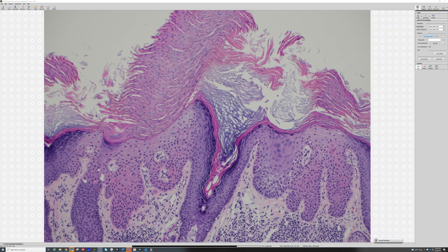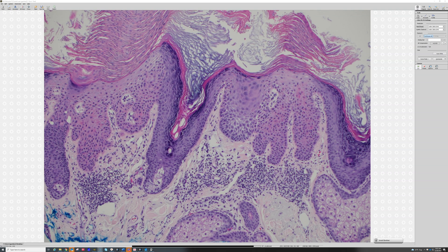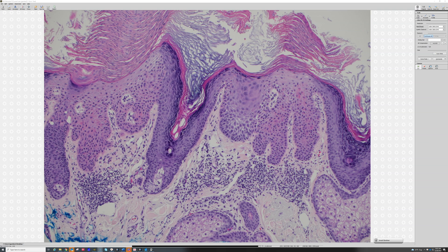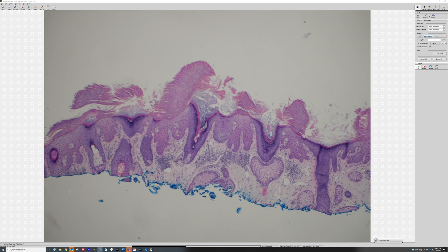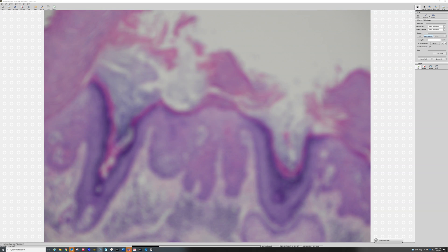Another nice feature of this AK is that actinic keratoses tend to make parakeratosis, and they also tend to spare the openings of adnexal structures, like sweat duct openings, acrosyringium, or hair follicle openings. This is a nice example because you can see that you've got parakeratosis, and then it skips past this hair follicle opening, and over the hair follicle you have nice, loose, basket-weave orthokeratin.